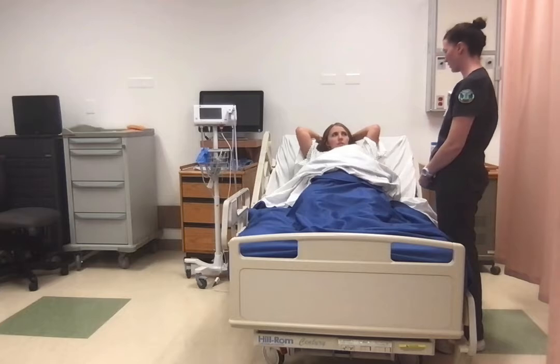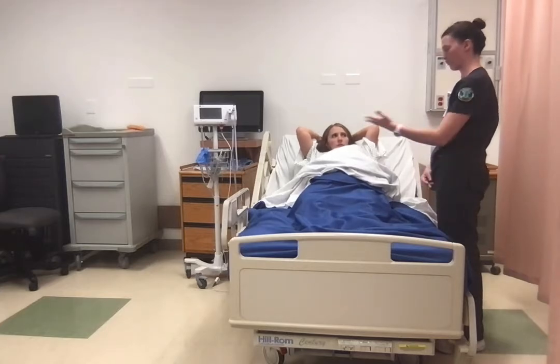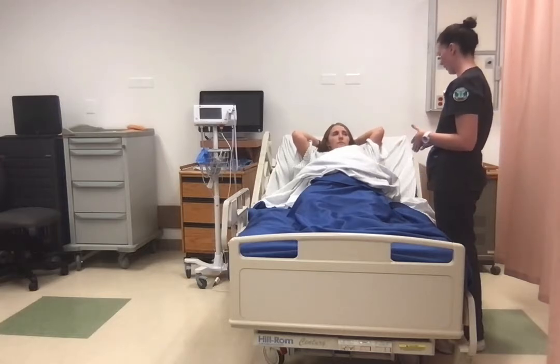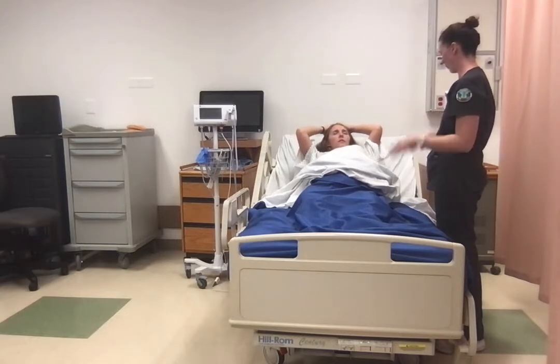Okay, and so with that, in that position, was my baby's heart rate still? Yes, your baby's heart rate didn't have any decelerations with that position change. You're still looking very good. Still moderate variability and absent of decels. Heart rate is averaging around 160.